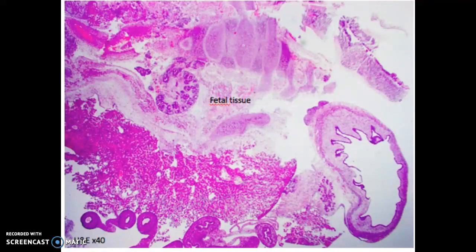So in this case, we don't really see exactly a ruptured fallopian tube containing all of this fetal tissue, because we don't really see a muscular disruption of the fallopian tube aside from the sloughing off of the surface epithelium.